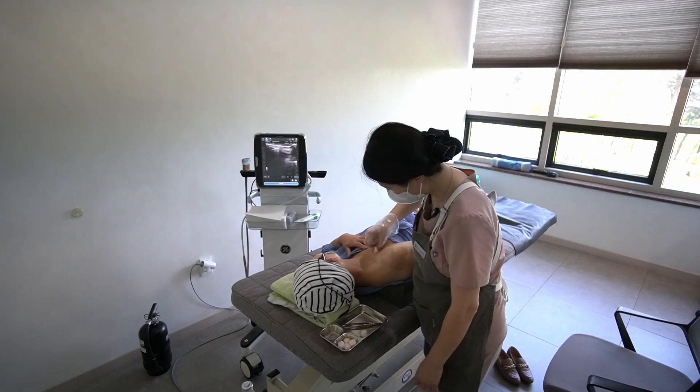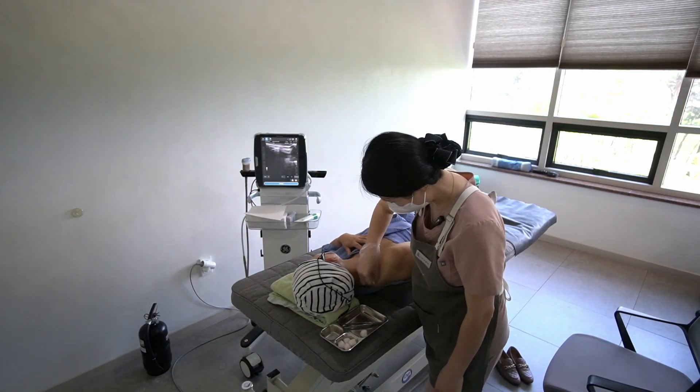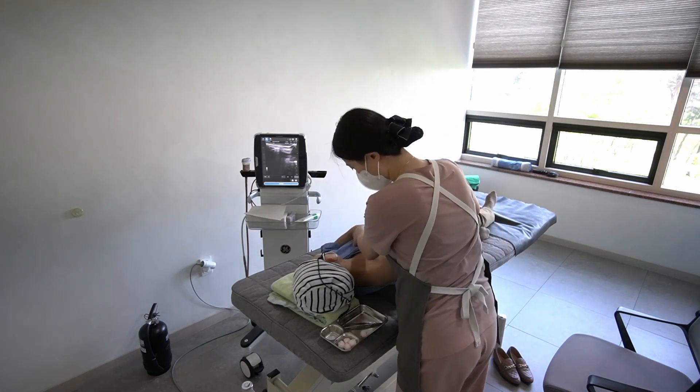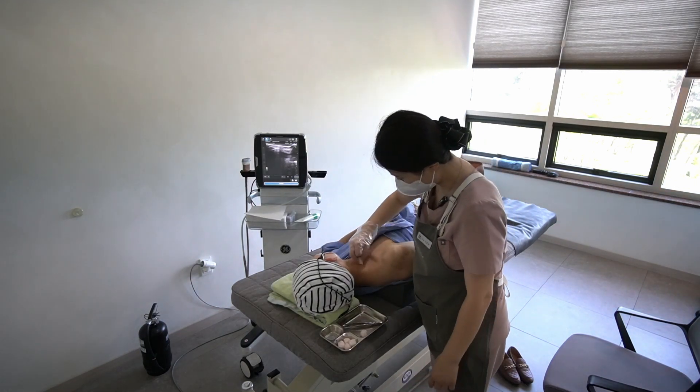While I have always had access to two ultrasound guided and two C-arm guided procedure rooms, this new equipment represents a meaningful improvement in the quality of care we can provide.